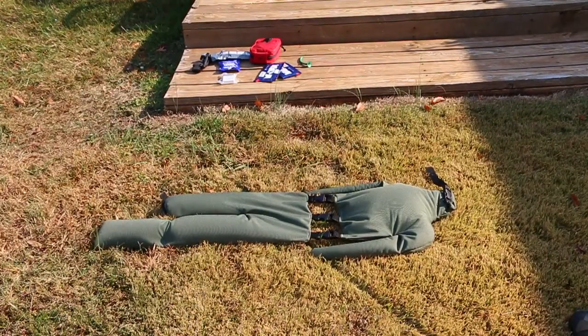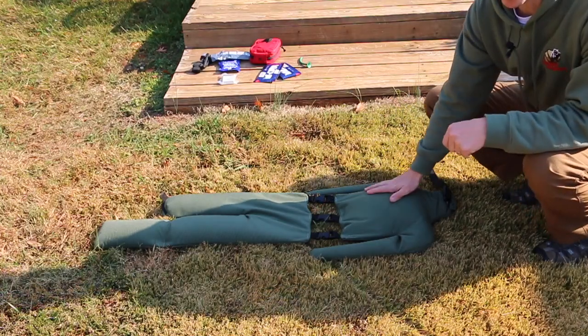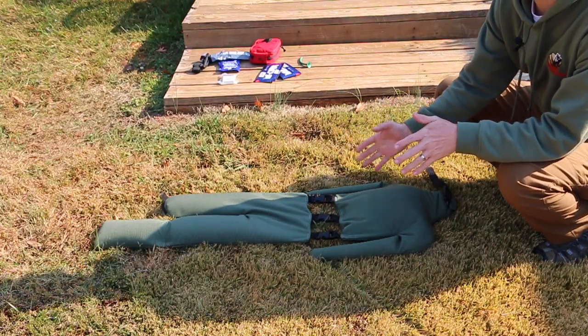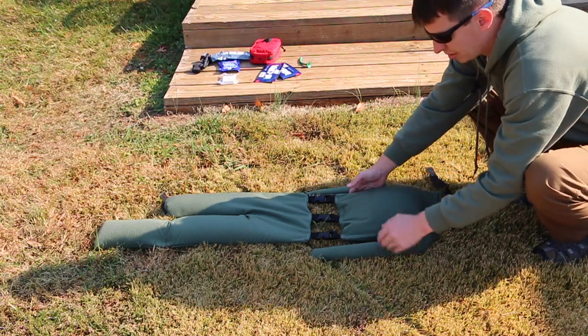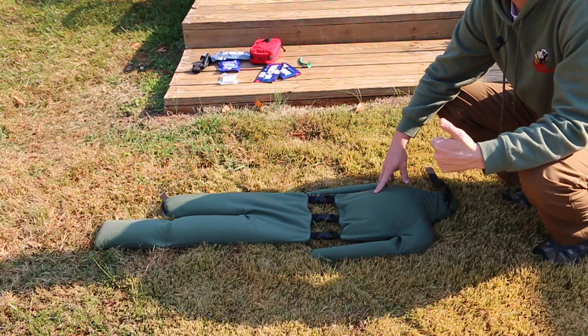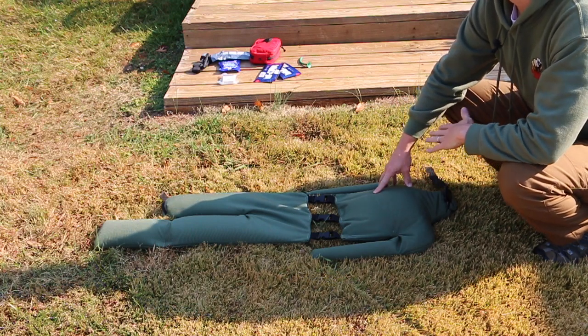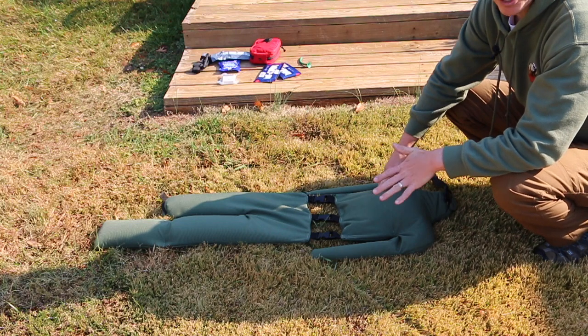Alright, so the first part of our process here, we want to look for major hemorrhaging, major bleeding. So you've got to expose the patient. If you don't have them exposed, you can't see. You may see a large pool of blood underneath them or running out, obviously. So we're looking for major bleeding. This is going to be bright red blood squirting or just uncontrolled bleeding that we believe is life-threatening. You're not worried about abrasions, things like that.